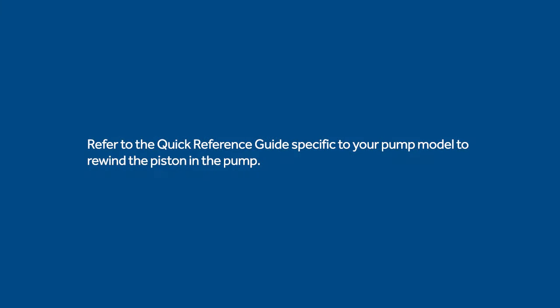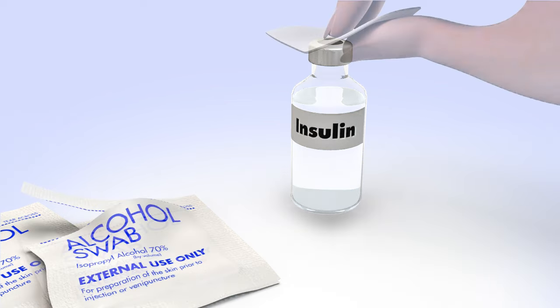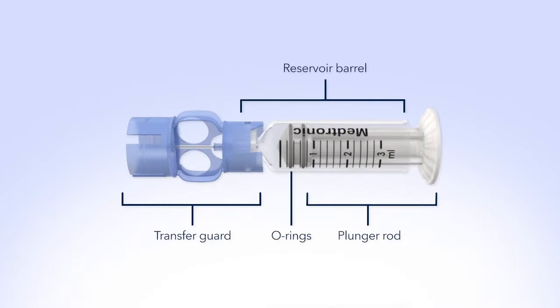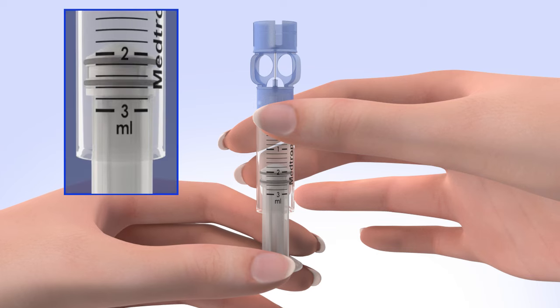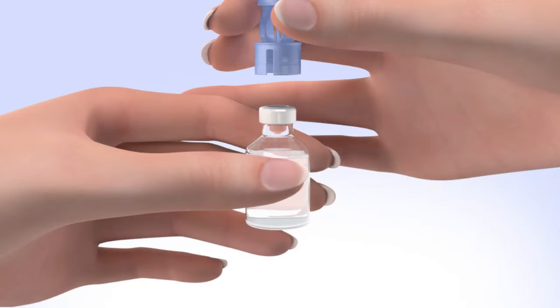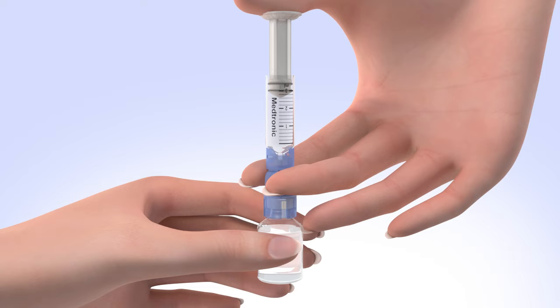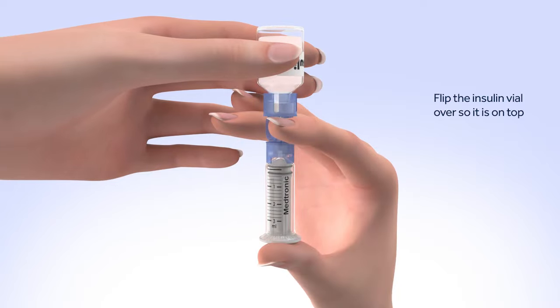Now you will need to rewind the piston in your pump. Refer to the instructions in the quick reference guide specific to your pump model. To reduce the risk of air bubbles, make sure the insulin vial is at room temperature. Wipe the top of the insulin vial with alcohol and wait until it dries. Remove the new reservoir from the package. Pull the plunger so the top O-ring is positioned at the amount of insulin you plan to put into the reservoir. Be careful not to pull the plunger completely out. Hold the reservoir by the blue transfer guard and connect it to the insulin vial by pressing down. Do not push down on the plunger during this step. Keep the insulin vial upright, place your thumb on the plunger, and firmly push the air from the reservoir into the insulin vial. Holding the plunger with your thumb, flip the insulin vial over so it is on top. Make sure you are holding the vial with your other hand.